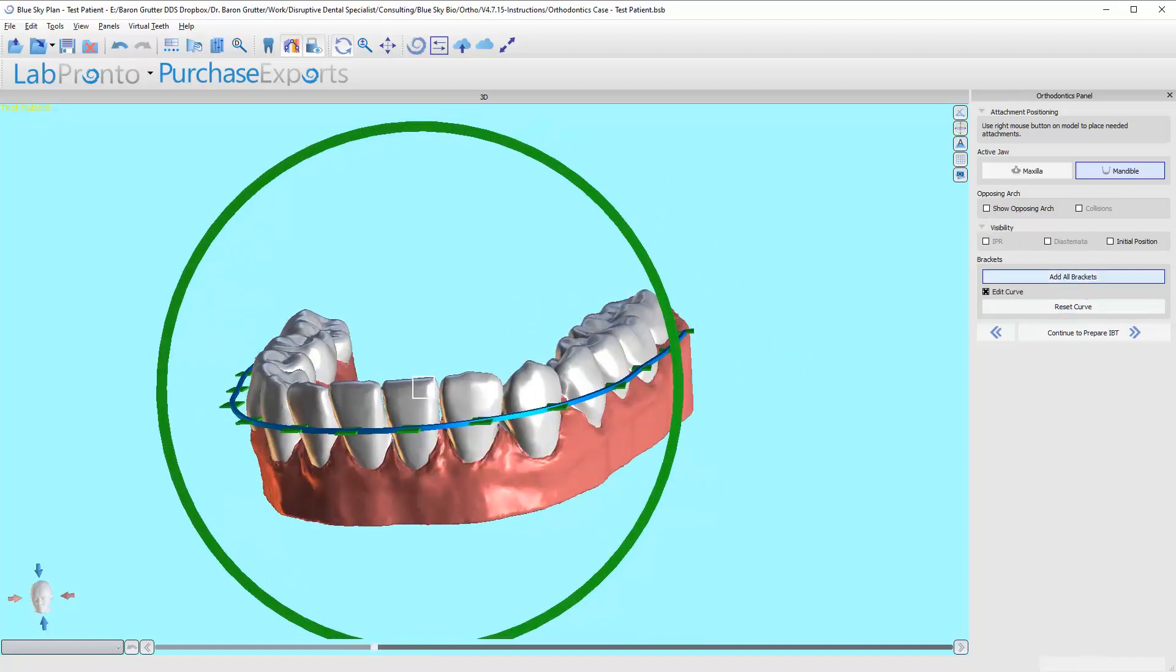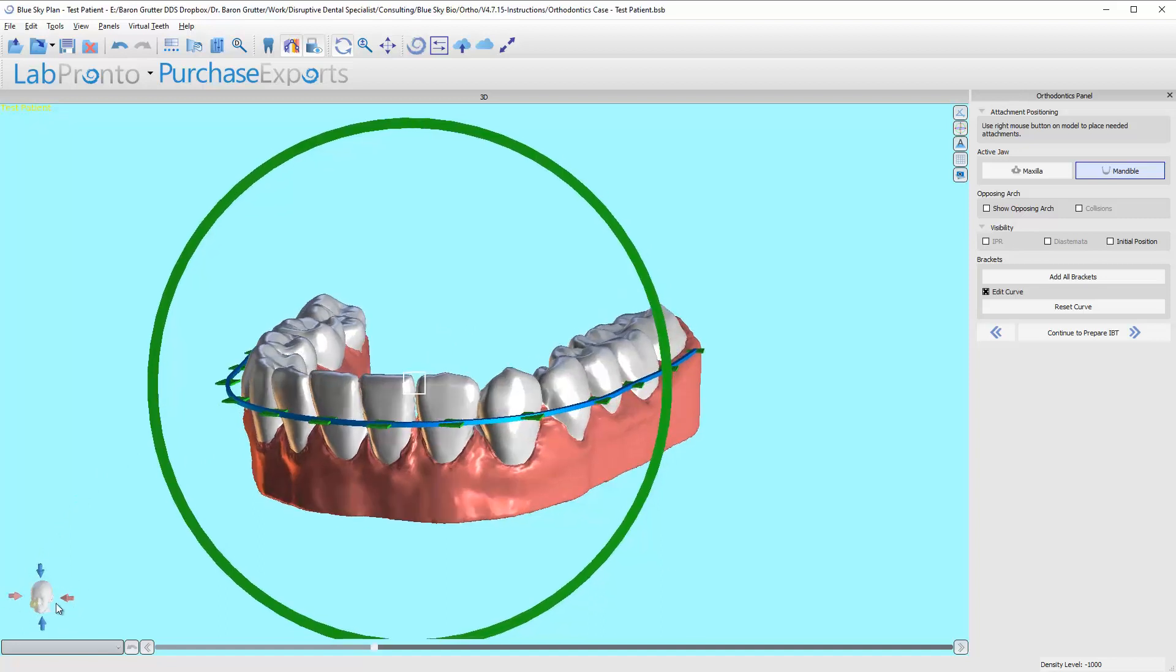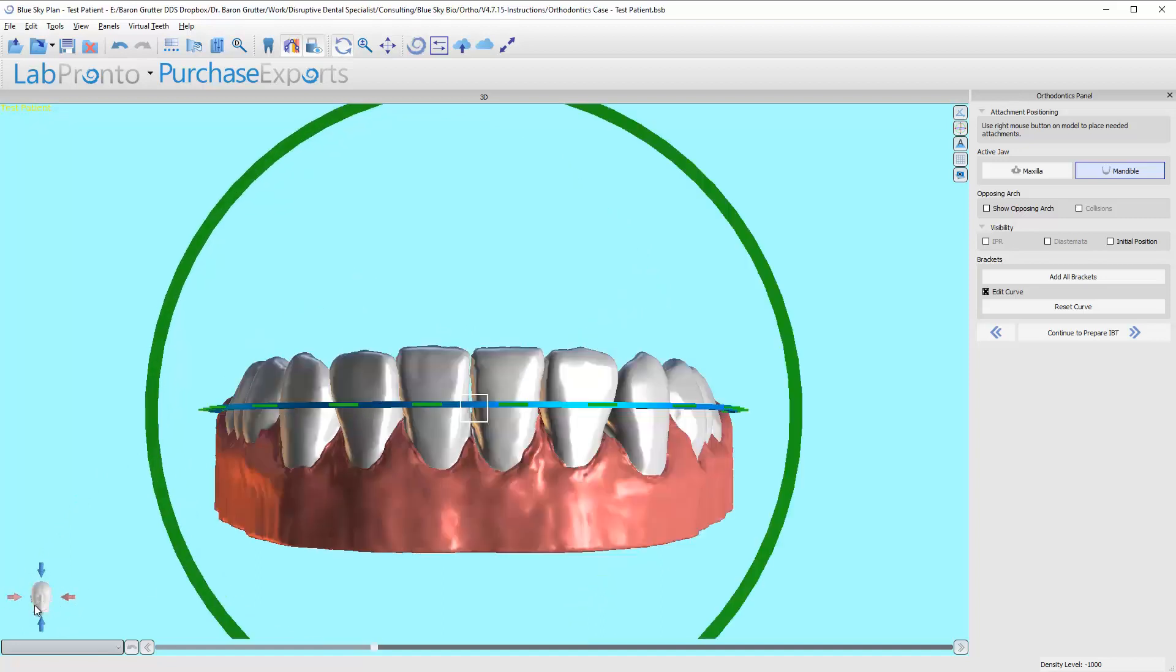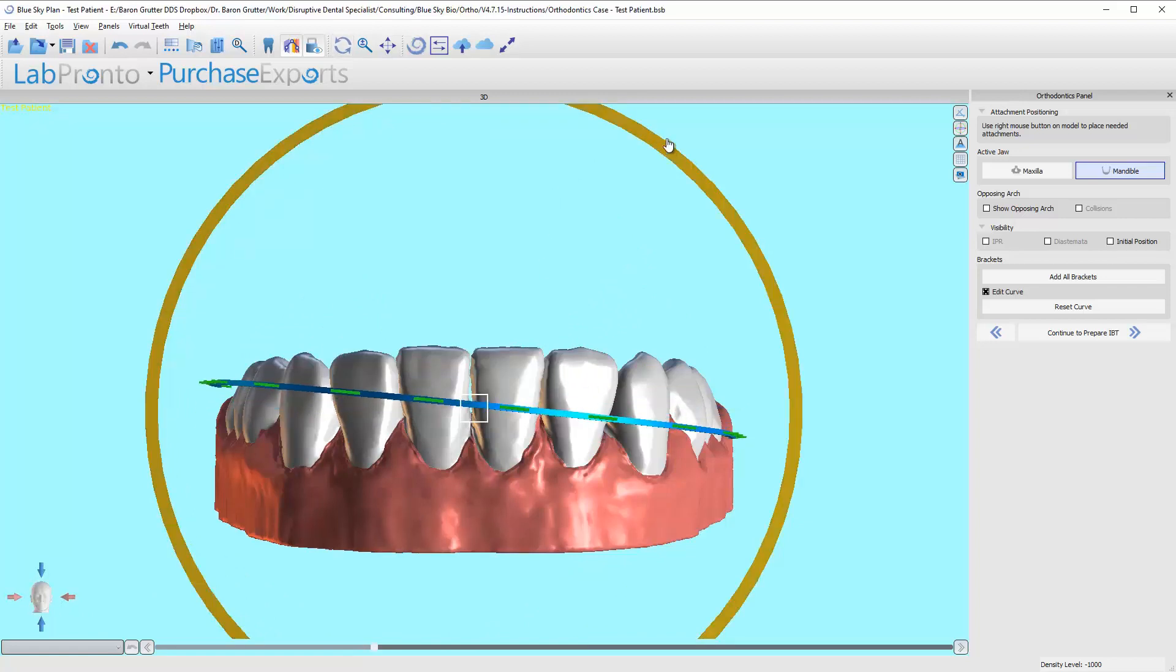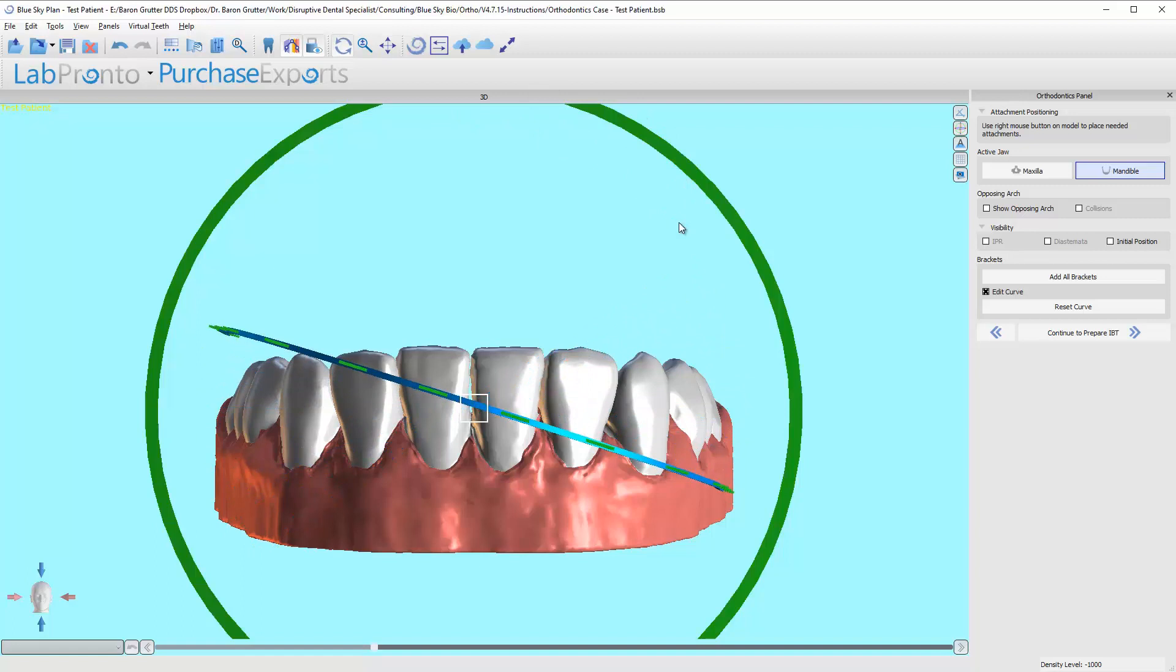Coming over here you can also use this reset curve, this little button. And this button right here is going to add all the brackets, but let's first idealize this curve. What I suggest is that you come down here to the little 3D head guy and click right on the center.